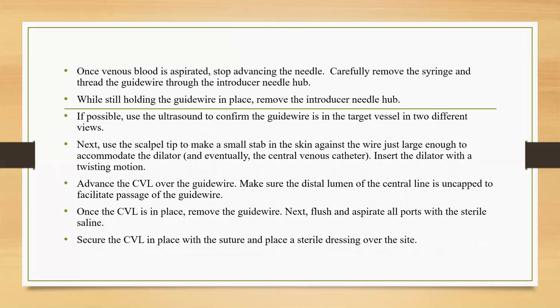Carefully remove the syringe and thread the guide wire through the introducer needle hub. While still holding the guide wire in place, remove the introducer needle hub. If possible, use ultrasound to confirm the guide wire is in the target vessel in two different views.